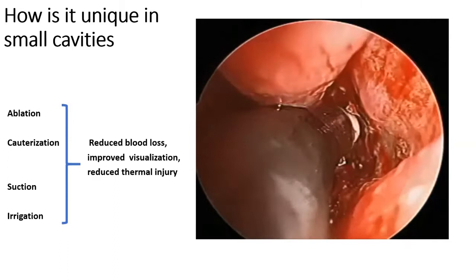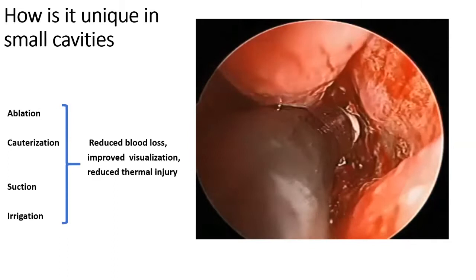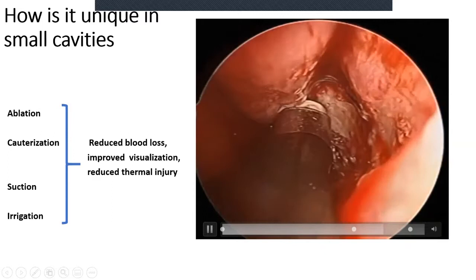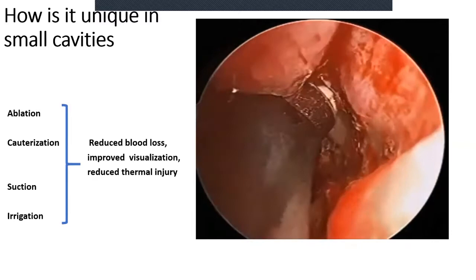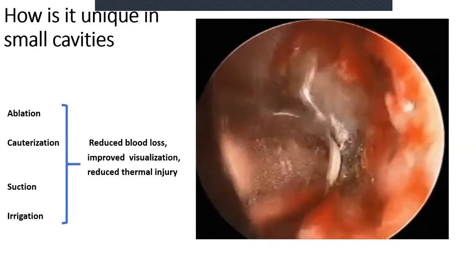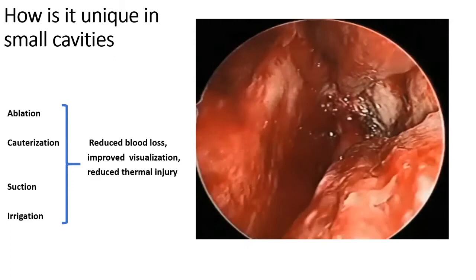These four functions can be beautifully demonstrated when ablating bleeding from the sphenopalatine artery. This is a 70-year-old patient on aspirin called for intractable epistaxis — we were able to decently control the bleeding from this medium-sized blood vessel.